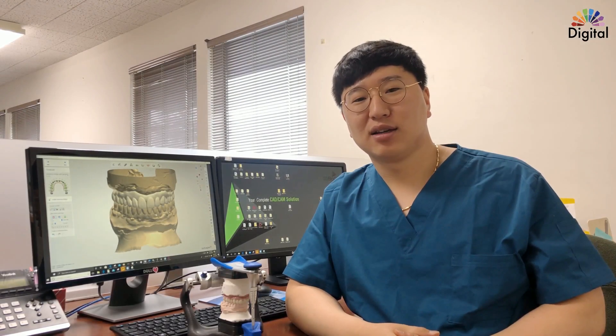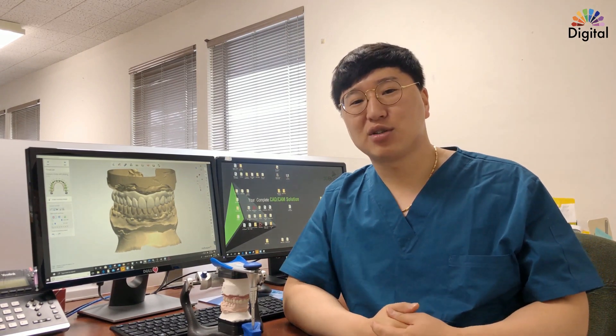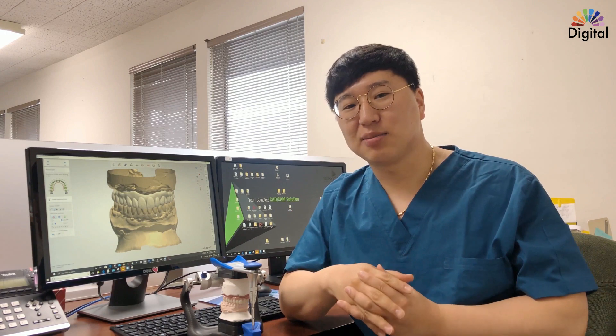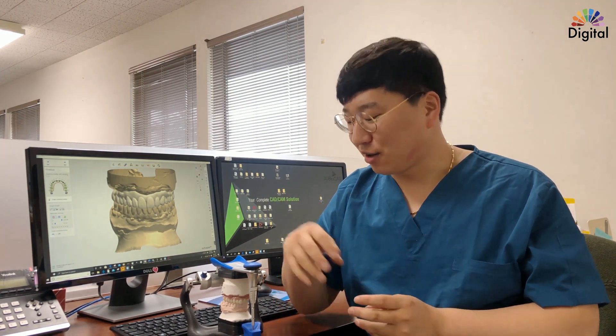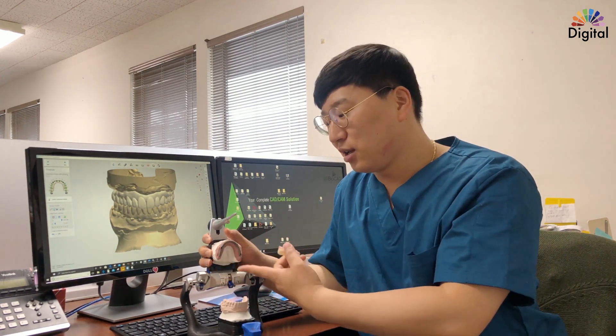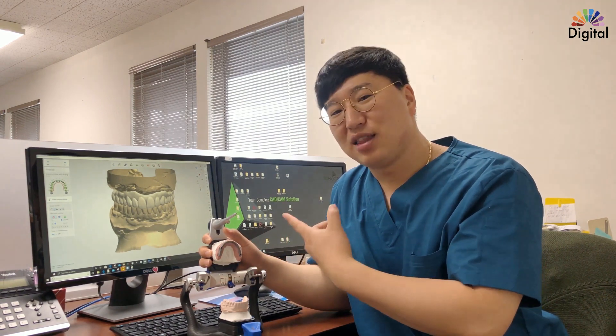Hi everyone, welcome back to the Digital Highlight channel. I have one implant full arch restoration today. It looks the same as normal cases but has a little something special underneath. The big difference is we have only three implants, and I used a titanium bar to make it work. Let's see the details.